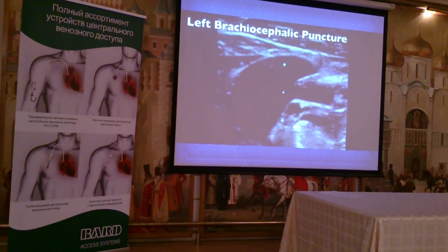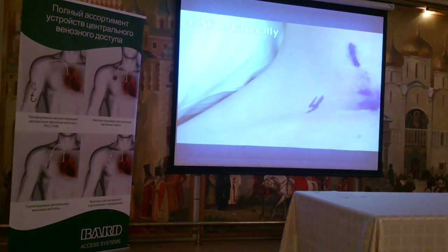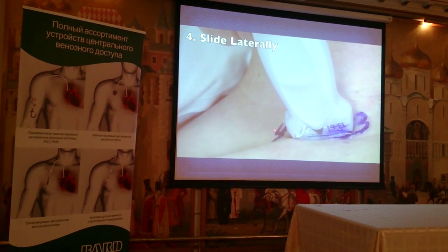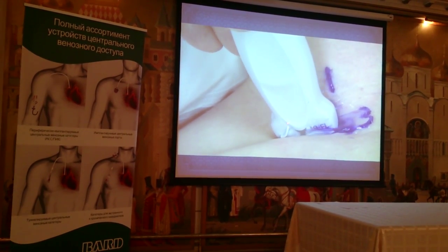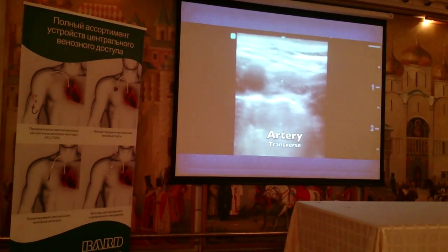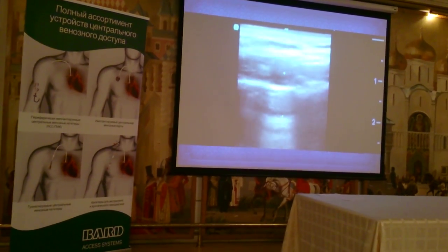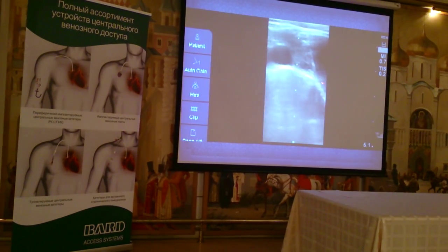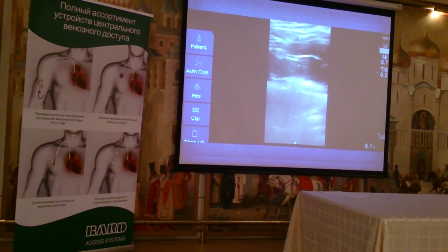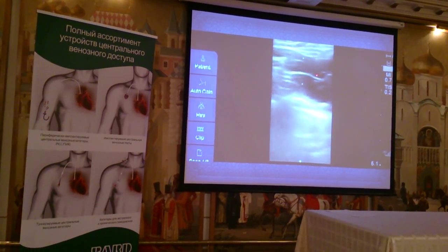This brachiocephalic approach is preferred for dialysis catheters and large-bore catheters. Position four is when, from positions two and three, you slide laterally in the supraclavicular area. Here you can see the subclavian artery in cross-section and the subclavian vein in longitudinal section — a nice look at the subclavian artery. You can also see the external jugular vein, and we can try to follow that down as it joins the subclavian vein just before it becomes the brachiocephalic.